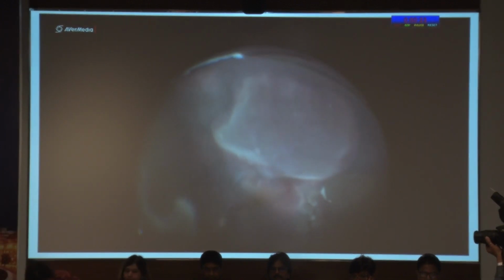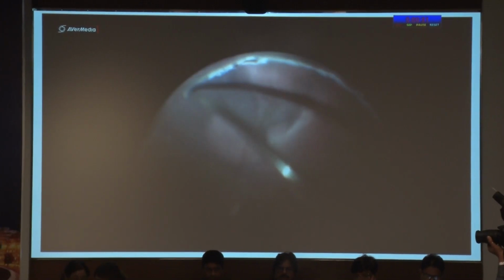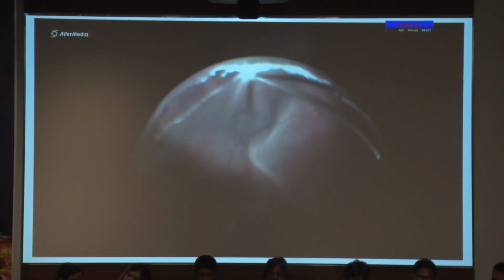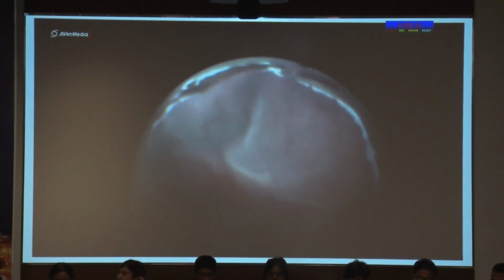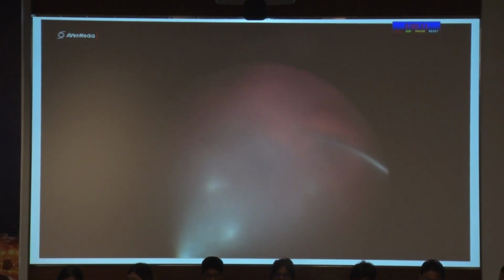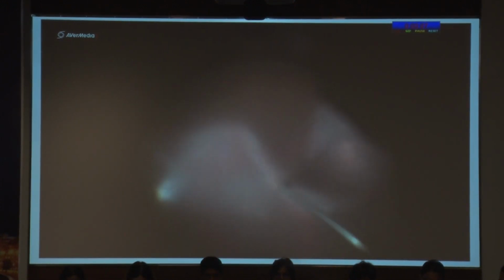In the inferior part of the retina, 180-degree endocautery was performed, followed by 180-degree retinectomy with the cutter. The entire subretinal hematoma was drained out by the suction property of the cutter.